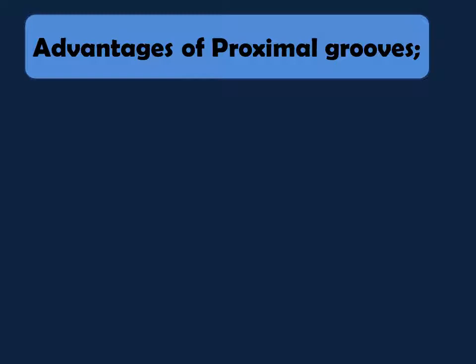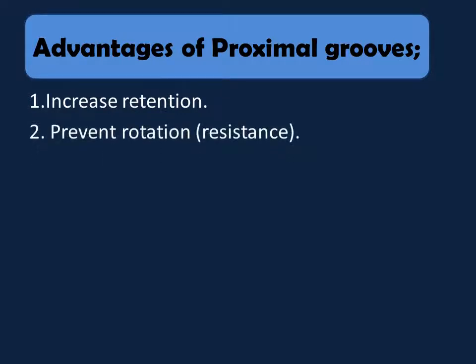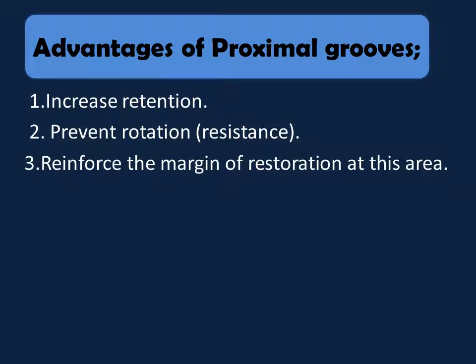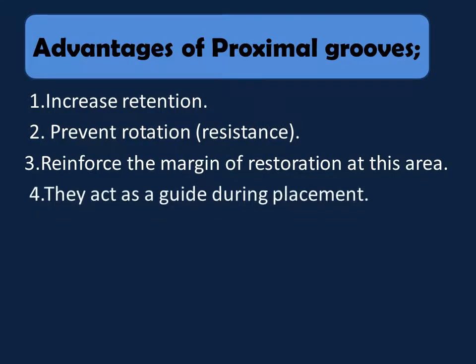Finally, it should be parallel to the long axis of the tooth. So the advantage of the proximal groove will be they increase the retention and resistance also by preventing rotation, and they reinforce the margin of the restoration at this area especially. Beside that, they act as a guide during placement.